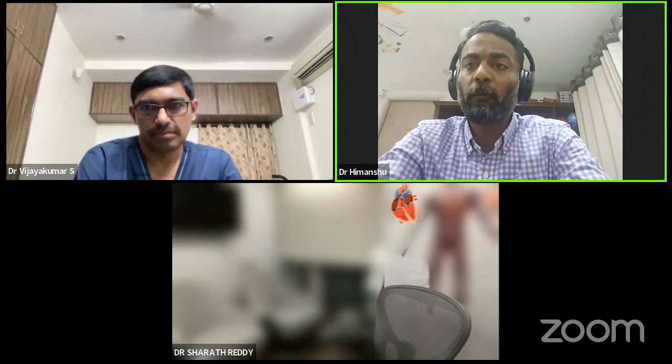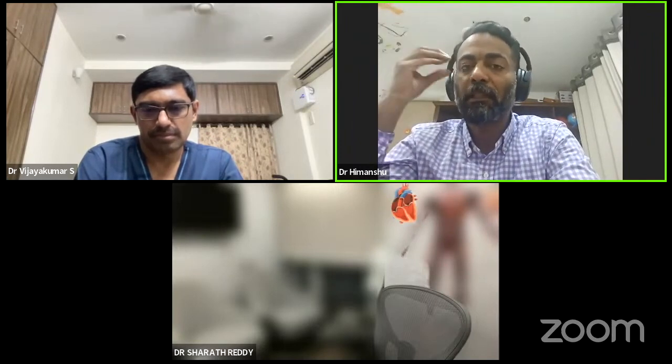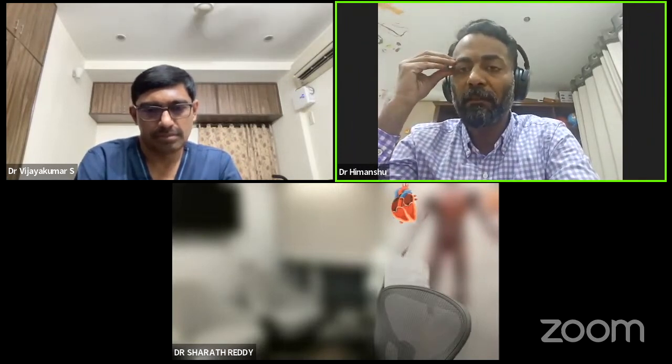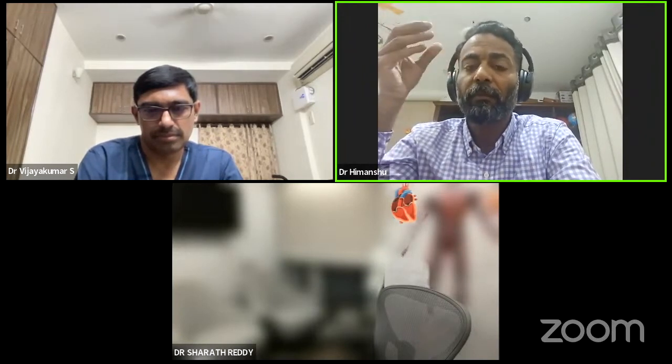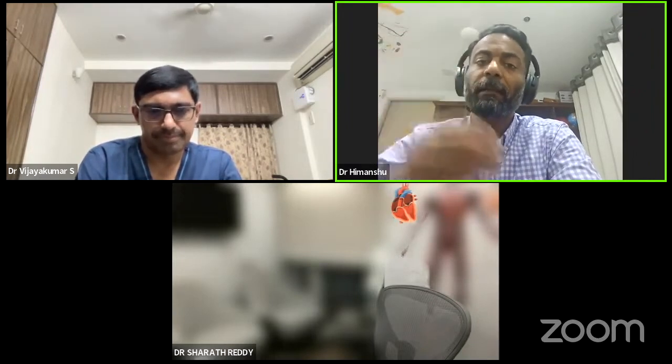Coming to technical, I would just like to say that the antegrade success in a procedure like this is almost less than 20-30%, I think. And the retrograde options are very limited. The only good retrograde option could be from the circumflex to PLV, but we couldn't see good connections. And also, of course, they're epicardial.